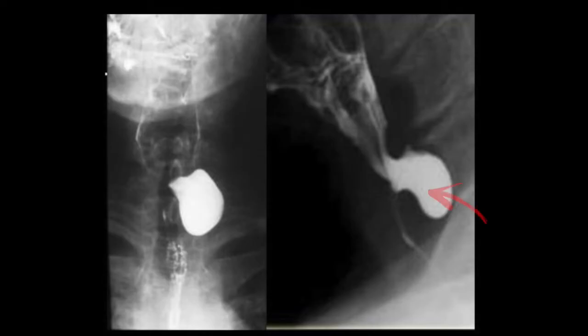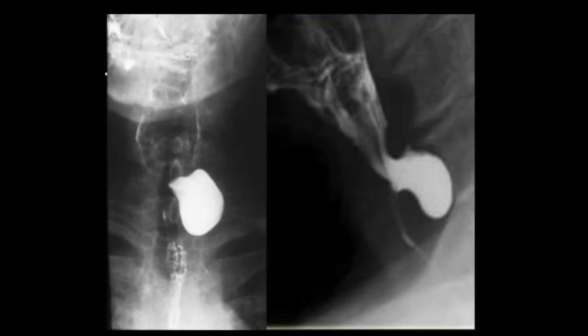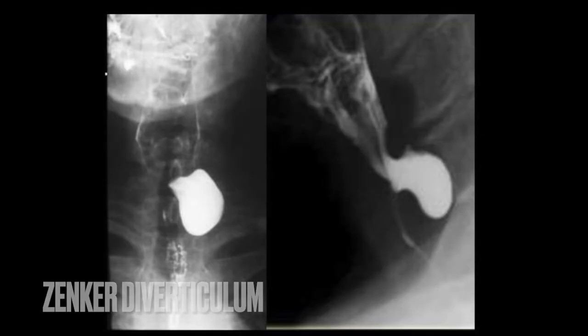In cervical esophagus films in AP and lateral views, a smooth outpouching from the posterior esophagus filled with barium extending inferiorly is a Zenker's diverticulum. Zenker's are pulsion diverticula occurring through Killian's dehiscence, an area of congenital weakness near the cricopharyngeal muscle, beginning just above the cricopharyngeal and usually posterior and slightly to the left. It's associated with gastroesophageal reflux and hiatus hernia. The Killian-Jameson diverticulum, by contrast, comes from the anterolateral wall of the proximal cervical esophagus and starts just below the cricopharyngeal level.